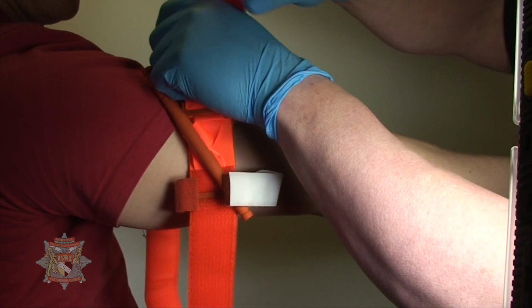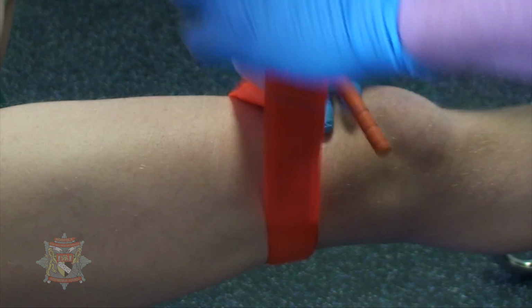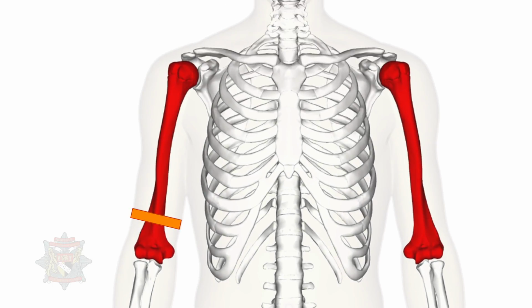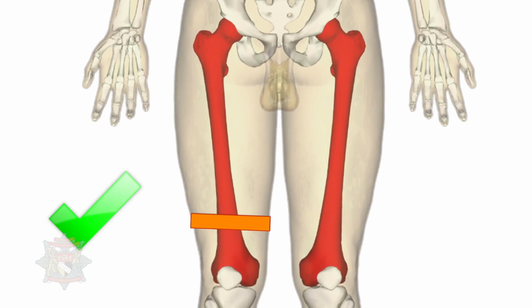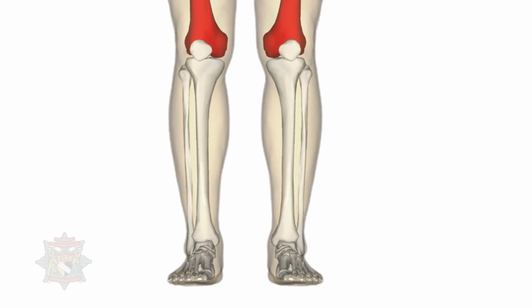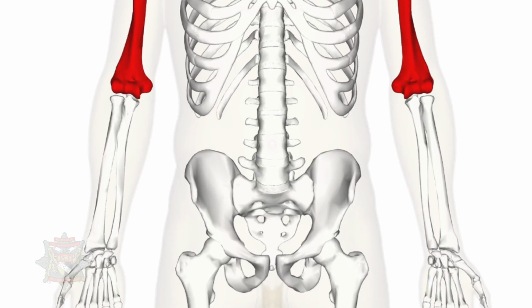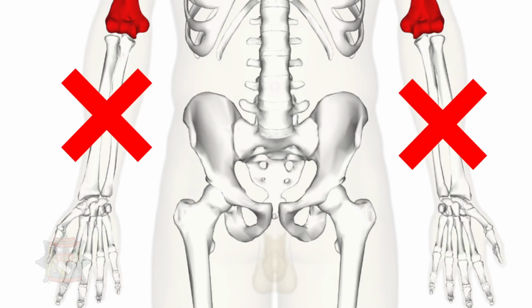The tourniquet must be positioned on the upper part of the limb, upper arm or thigh. These are single bone compartments where the blood vessels can be effectively compressed against the bone. Placement of a tourniquet over a double bone compartment, lower leg or lower arm, is less effective as the twin bones in these areas may protect the blood vessels from adequate compression from the tourniquet.